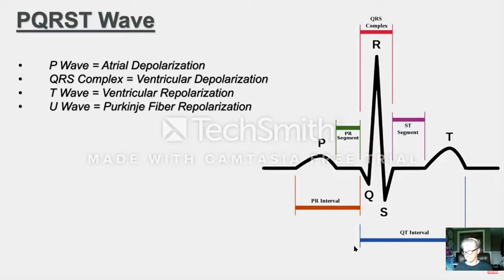Now, in some cases, you may see a U wave, and that is thought to be due to Purkinje fiber repolarization. You're not going to always see this, but I just thought I would add this here for completion.